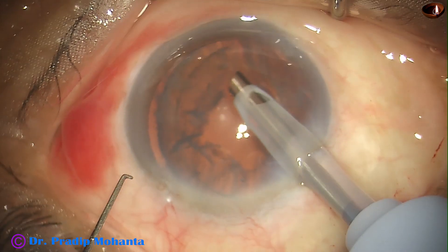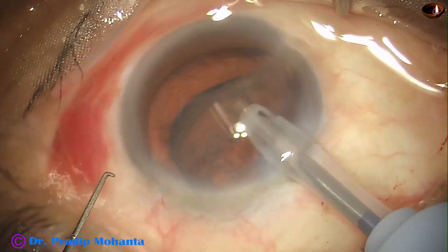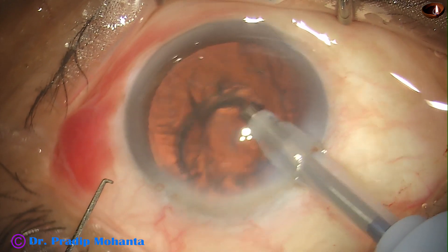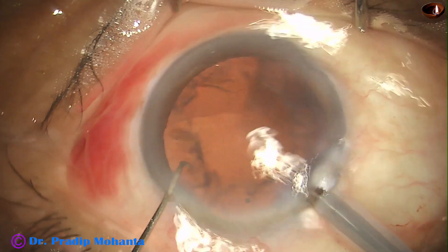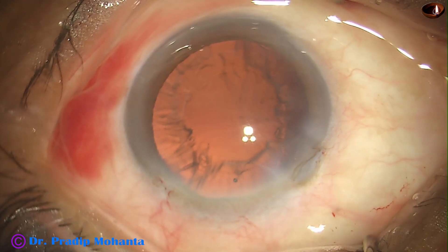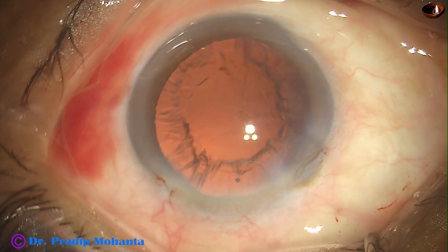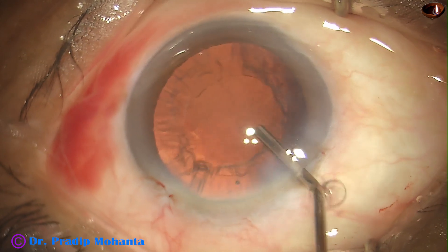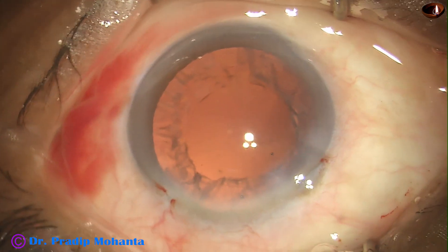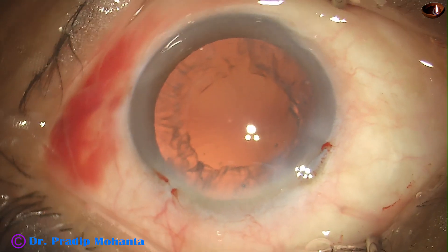This is the epinucleus. As soon as the epinucleus is removed, the red glow again increases. Now cortical clean-up will be just a matter of joy with this beautiful red glow.